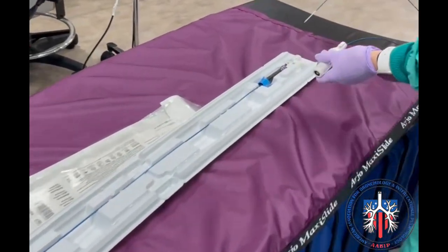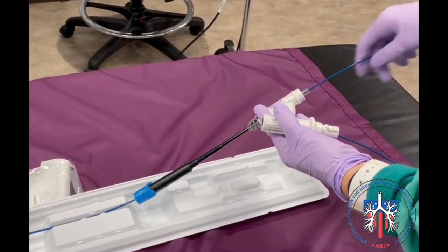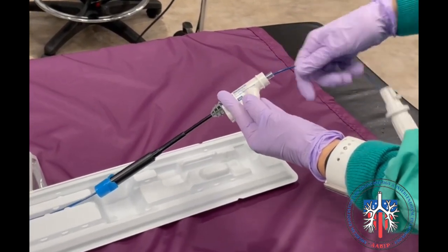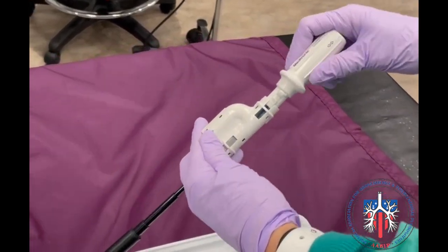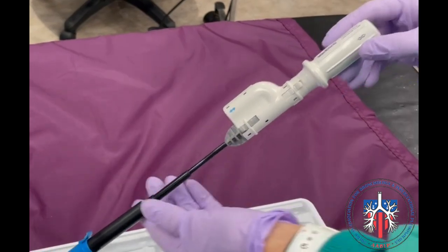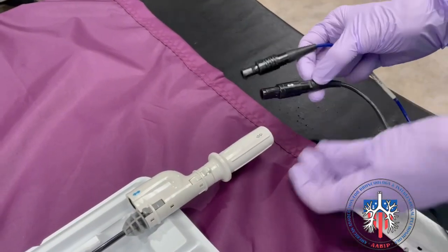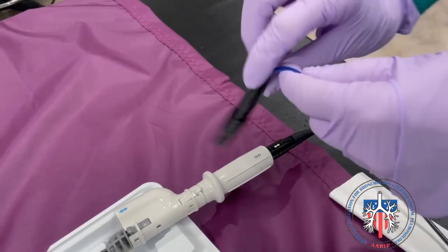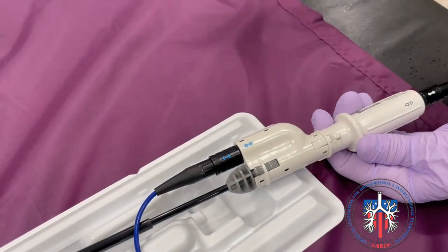This is an example of a locatable guide and catheter extended working channel assembly. The locatable guide is inserted into the extended working channel and locks into place. The cables to the locatable guide and the extended working channel are then attached — first the black locatable guide cable, then the blue extended working channel cable.